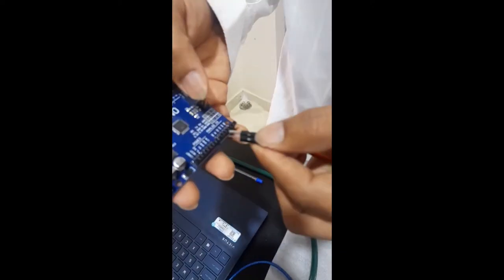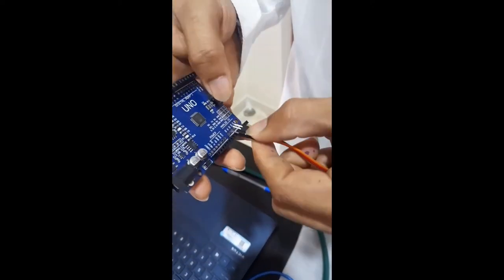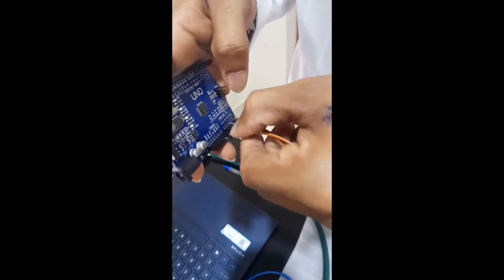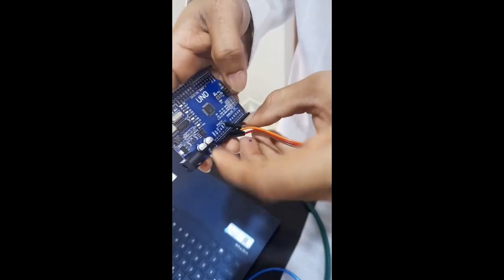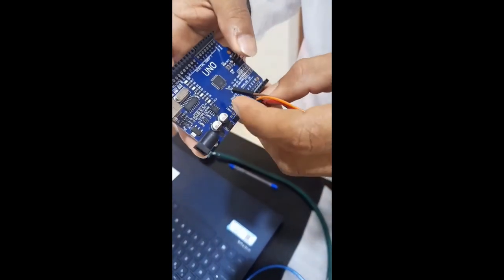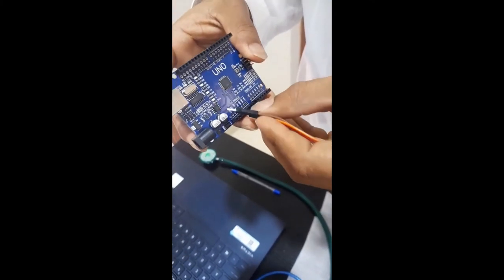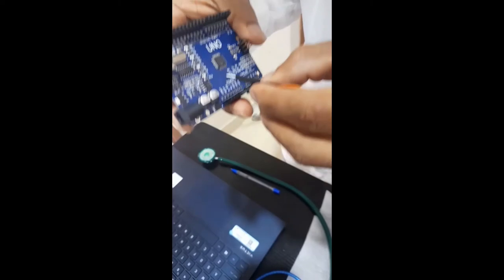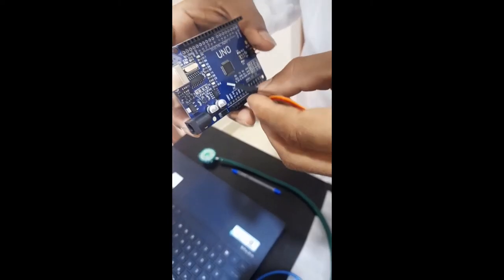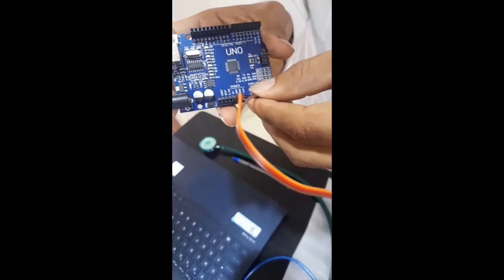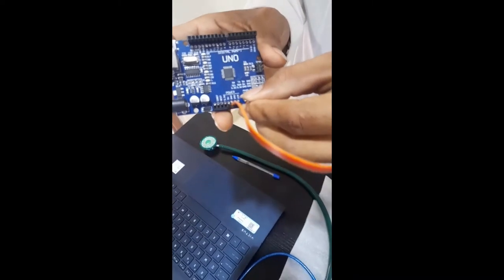The orange wire I have connected to the 5V power source, one for the ground, and one for the analog pin A0.